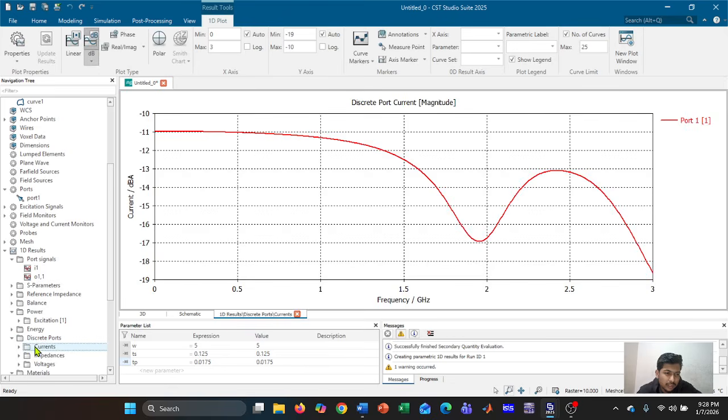Result, current. This is the discrete port current magnitude. Current rises when the signal starts and then goes down smoothly. It shows normal antenna behavior with no instability.